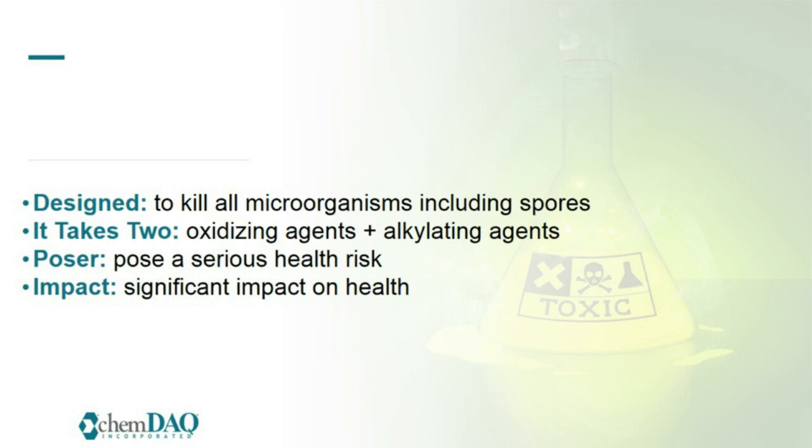I like to call these two posers because both of these agents pose a serious health risk to anyone who is exposed to them. So it's very important in your department to ensure that you have something in place to make sure that your staff know when they are in fact exposed. Next, the impact. We know that high concentrations and small leaks can have a significant impact on the health of your employees in the sterile processing department.